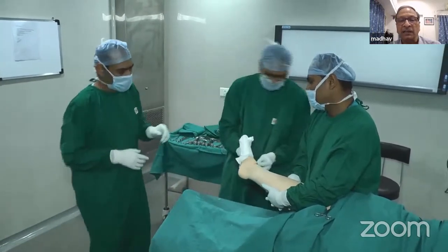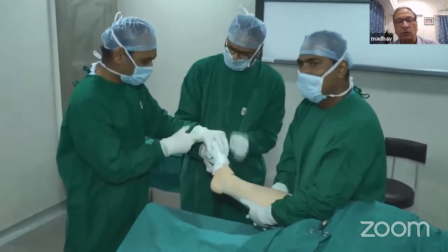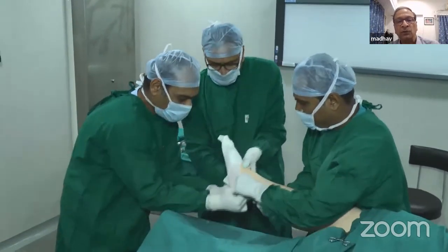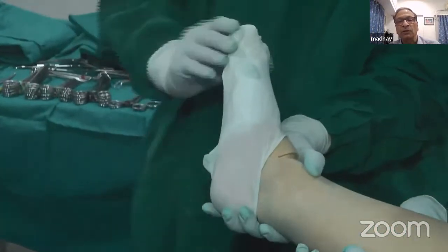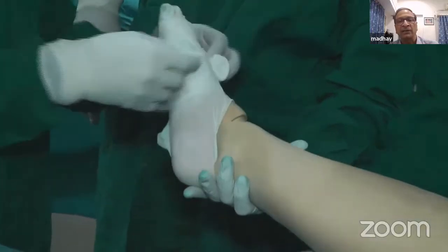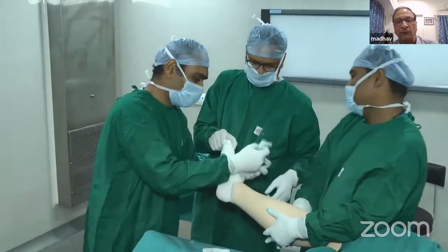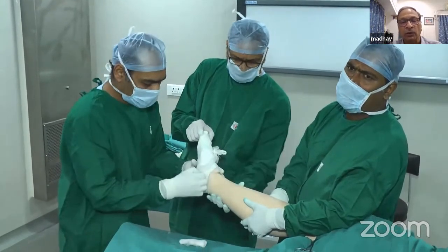Depending on the surgical area that you are operating on, you need to cover the part of the foot which you are not going to operate on with a mop, which you tie a knot around, and then to keep the mop in place, you turn a glove on it so that it remains in place. As you can see, you can put an extra bandage to secure the glove in place so that it doesn't slip off.